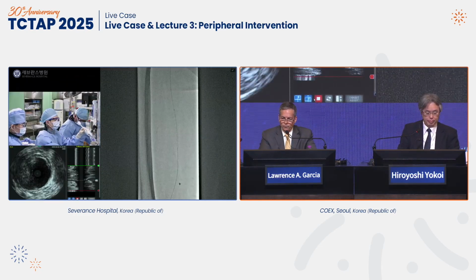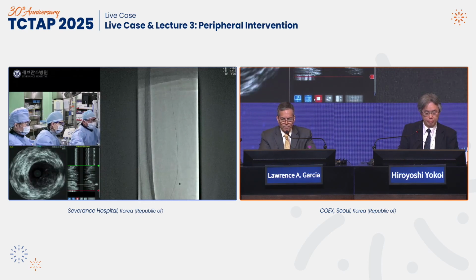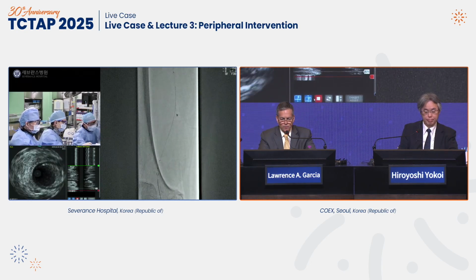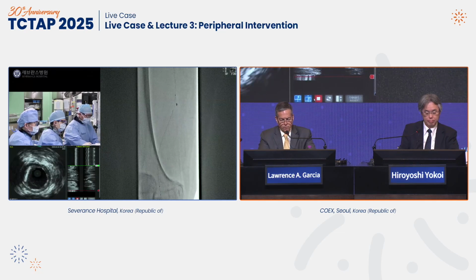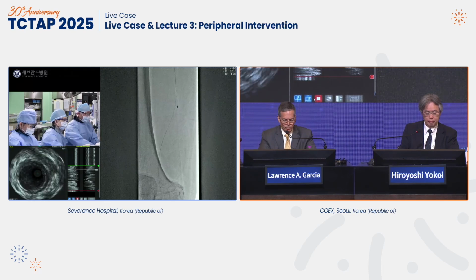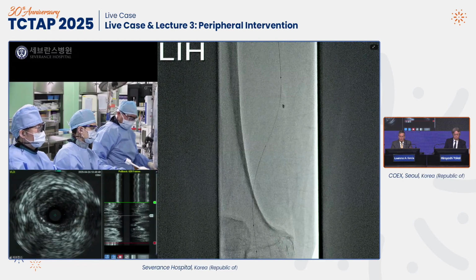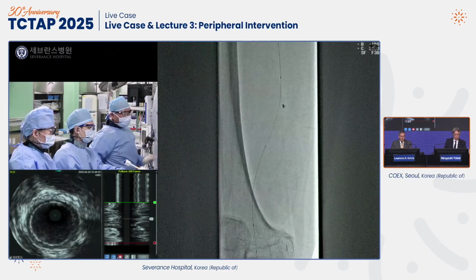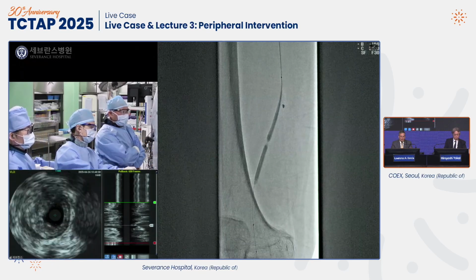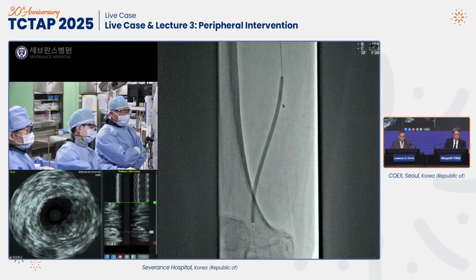Professor Ko, it came up a little bit higher, so I bring it up. Okay, so Dr. Ko, while you do your pre-dilatation, you're just using a simple balloon. We can have a discussion offline about the specialty balloons here. We do have a featured lecture. Do you want to let us get to that while you do your pre-dilatation? And then we can come back to you following the pre-dilatation for your final results?